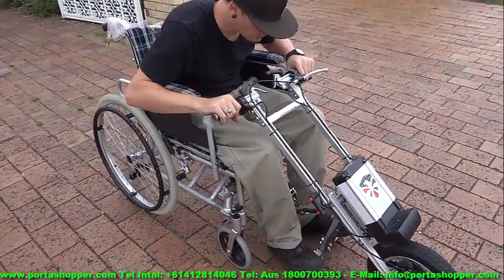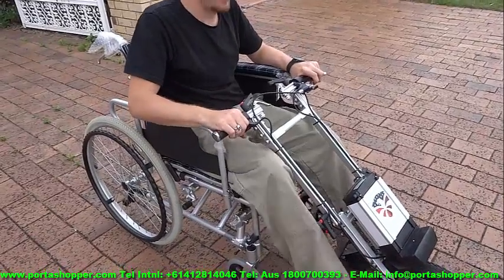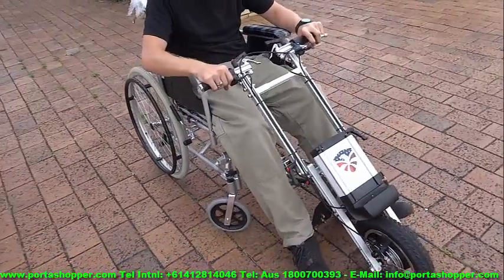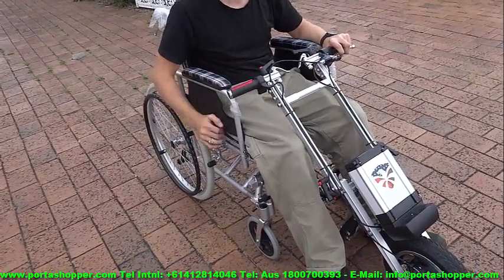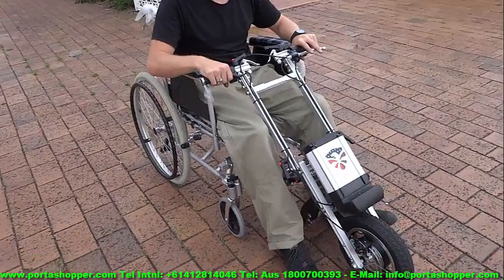Just to let you know, the instructions in this video are for both the 380 Portawheel, which is a 380 watt model, as well as the 680 Turbo or 680 watt model. This video will demonstrate some key points when you set up your new Portawheel, and the first is to make sure that your brakes are on when hitching up and reversing.